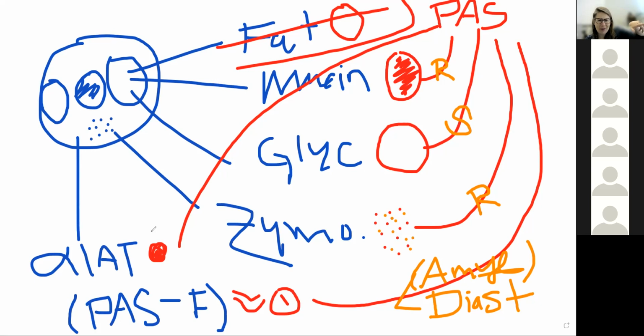I don't know about alpha-1 antitrypsin. I don't do liver. Is that sensitive or resistant? Isn't that one supposed to be resistant? I have a sure, vague memory of Dr. Hart teaching us this years ago. Awesome. Great. Okay. And fungus, we don't usually do a diastase on because we see the organisms and that's enough.